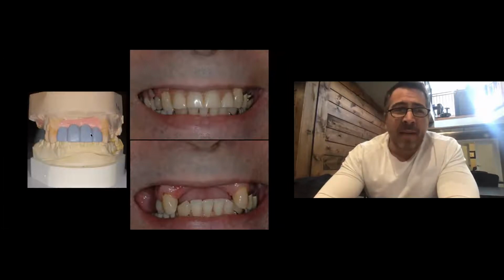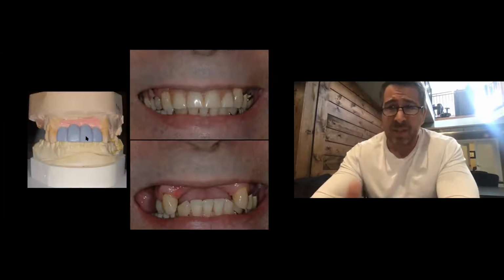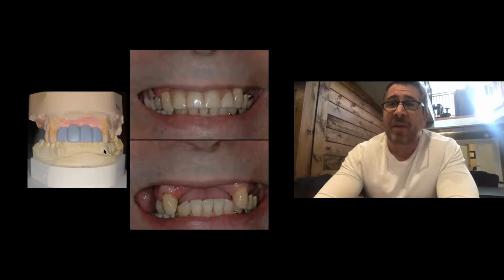So if I do a wax up and I fill it in, I can quickly take that wax up and I can make an Essex retainer out of it, fill it with ProTemp, seat it in the patient's mouth, and so show the patient what the teeth are going to look like. And once again, as I said from the beginning, you're going to end up with long teeth, long contact points. And the patient has to decide whether they're going to accept that or not. And in this case, the patient actually didn't accept it.